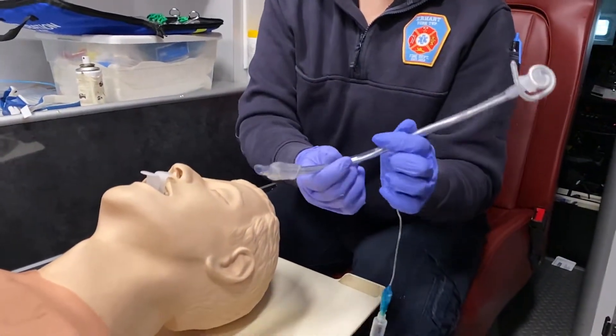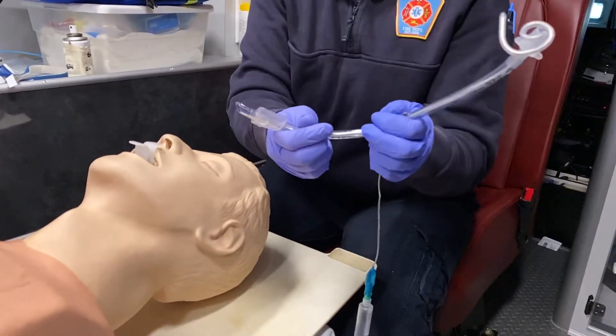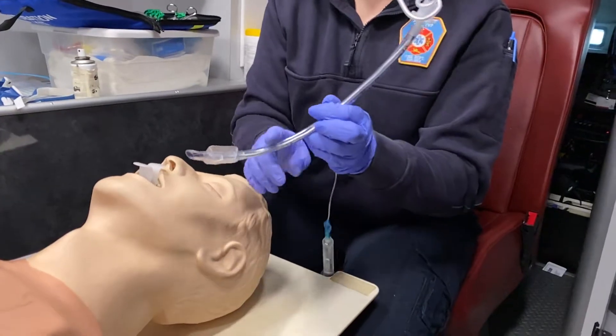Once we insert the stylet to a certain depth we can go ahead and bend that over the top. Some people like to bend their tubes like a hockey puck. I do a little bit, but not a very extreme one — I like to just do mine a little curve at the end.